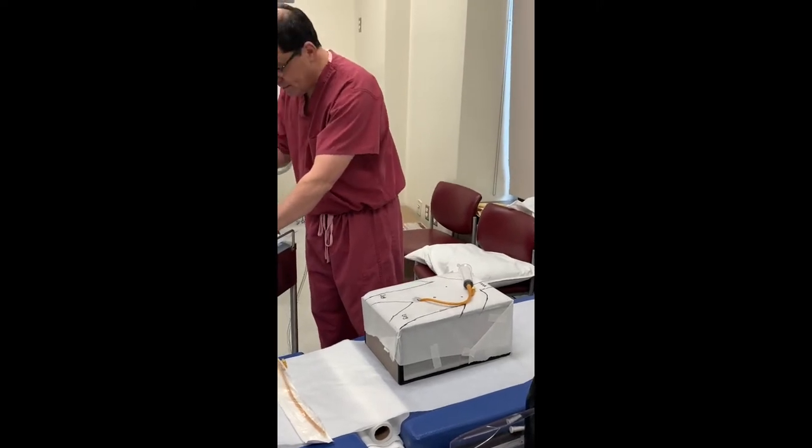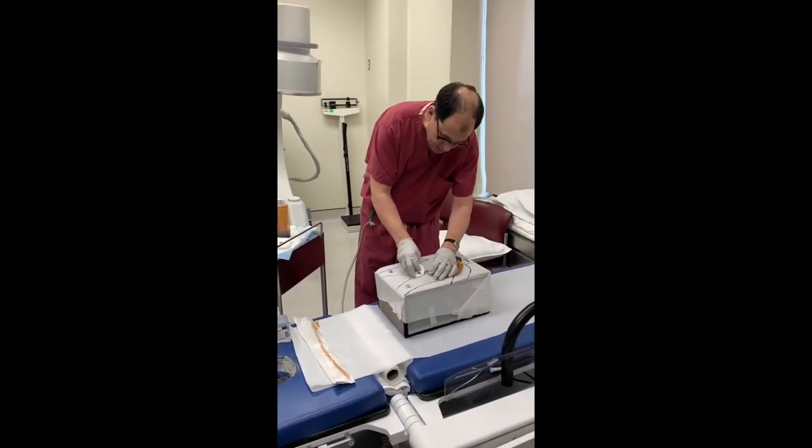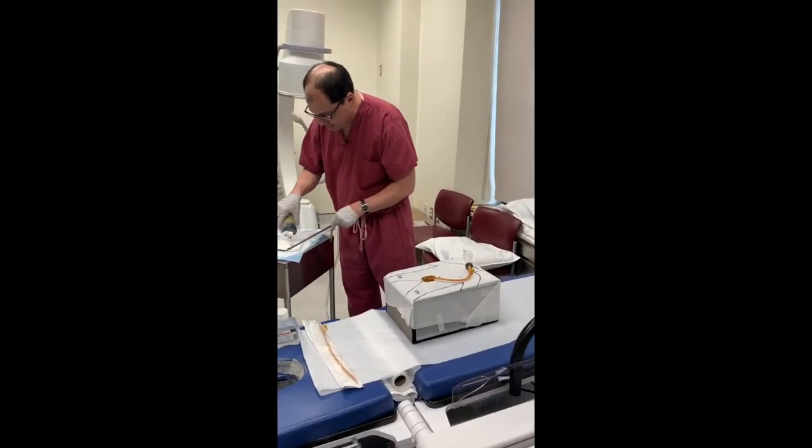Once you fill it, leave this connected. Take a little betadine and clean around the catheter site. Then save a little bit more betadine.